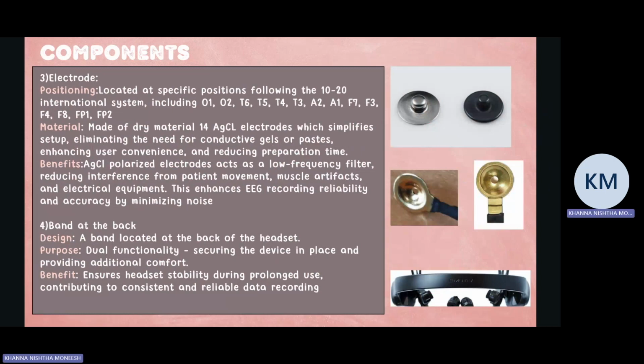The electrodes are located at specific positions on the scalp following the 10-20 International System. They are made of dry electrodes, specifically silver chloride electrodes, which simplifies setup by eliminating the need for conductive gel or paste. This enhances user convenience and reduces preparation time.